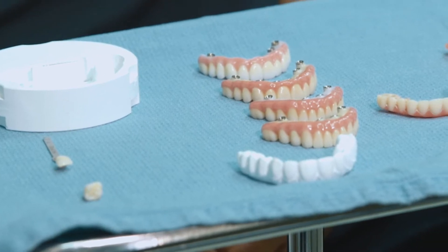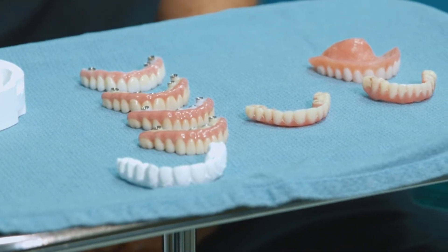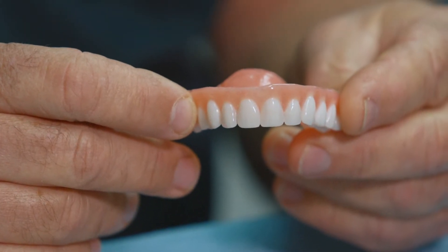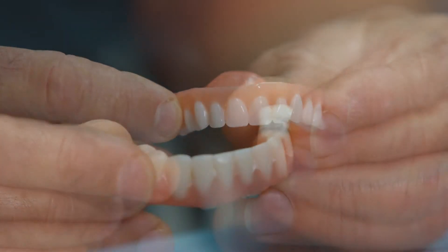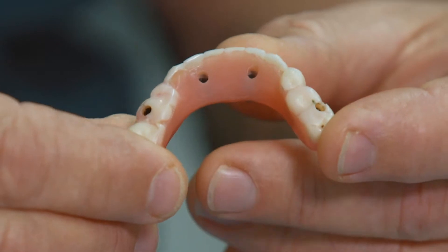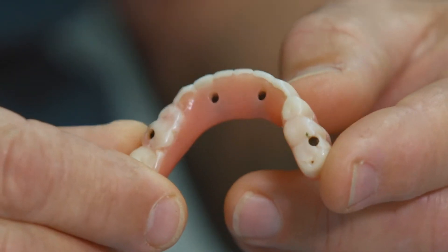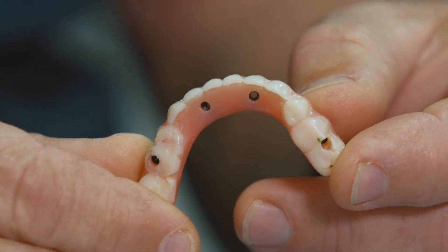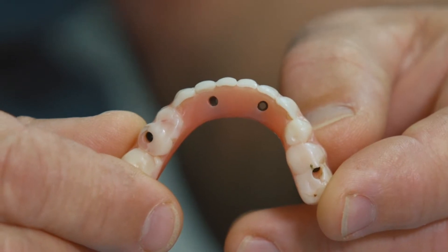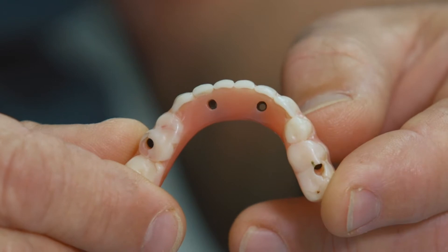Here we have several restorations — about three or four different materials. This is a denture, a plain old all-acrylic, all-plastic denture. Another type of acrylic prosthetic is this temporary set of teeth that would go on implants. This is a lower, and you can see there are four black holes — those are the four holes where the screws would go through to attach the teeth to the implants.